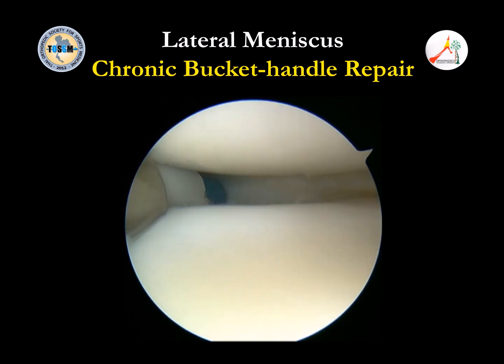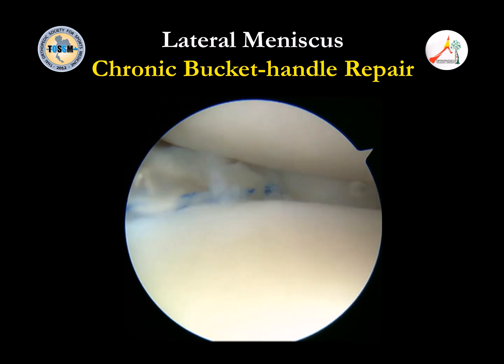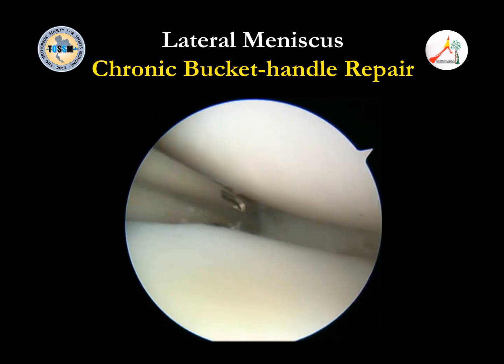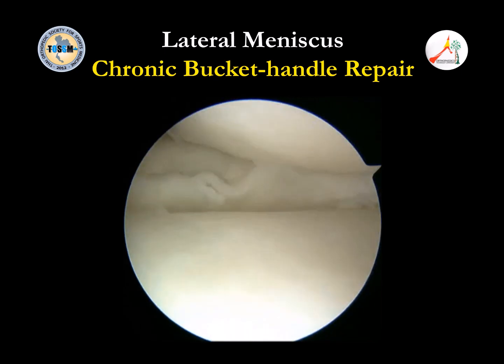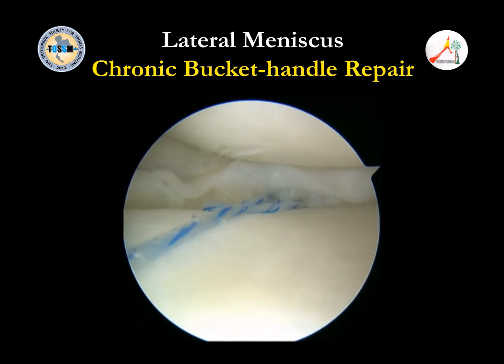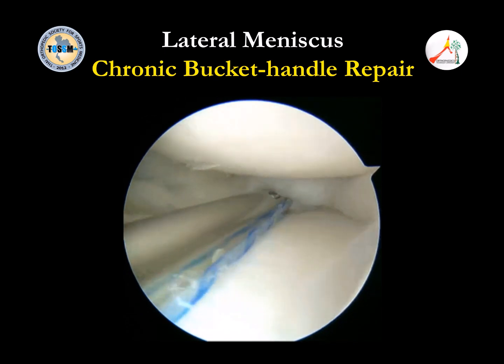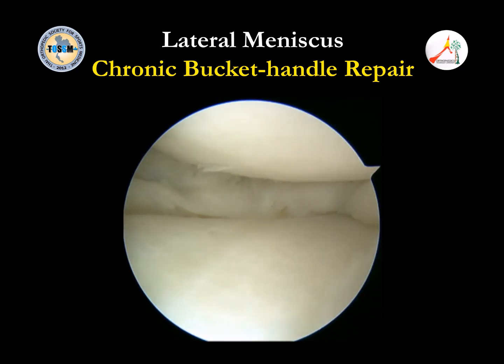So if you put the fixation in, you still have a big gap. When you tension, it gets out. Try to reduce first, and do not repair at the apex. You repair at the corner first because it's closest. This way, you repair at the anterior and posterior, close to the posterior horn.